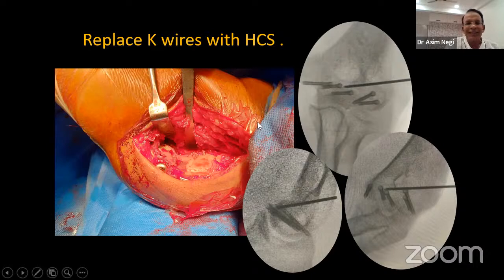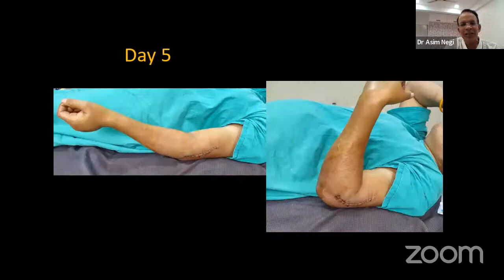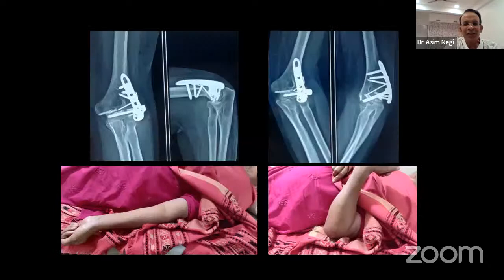Then it was buttressed with a lateral column plate, which we saw just now. And this is day 5, wound settled. She's fine. She's a comparatively middle-aged lady, not so osteoporotic. And she has got a full function.